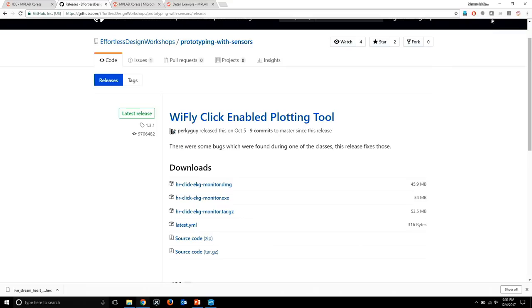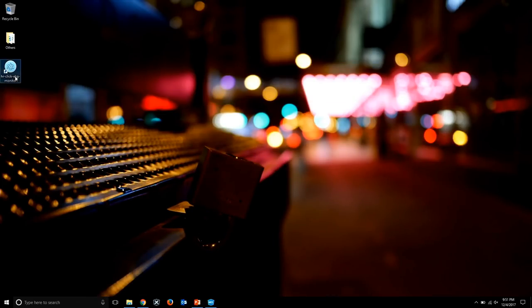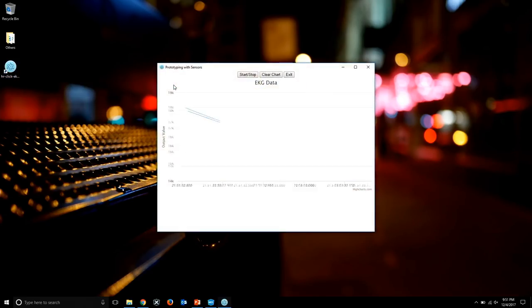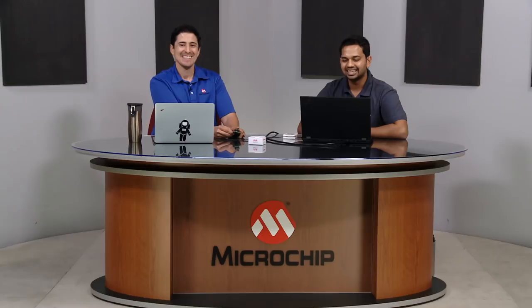Okay. So I have it downloaded and installed, so I'm just going to go back and open this up, which is a program that I already have installed. It's the standard installation process for any other software. And so you should be able to see some stuff. So there you go. Yeah, look alive. Nice. If you actually place your finger, let me set it on the board. Yeah, it's an optical sensor, obviously, based on how you hold it.